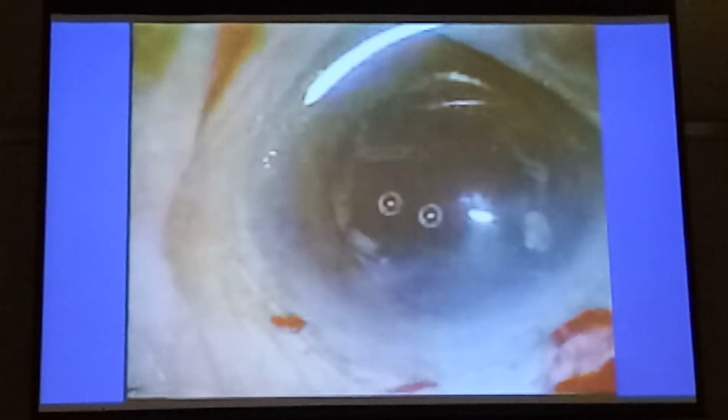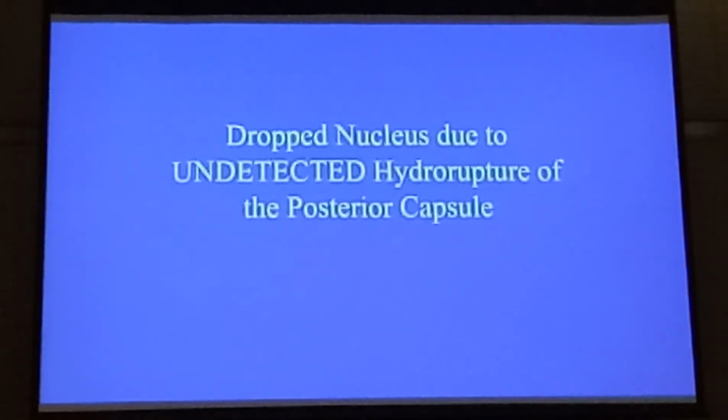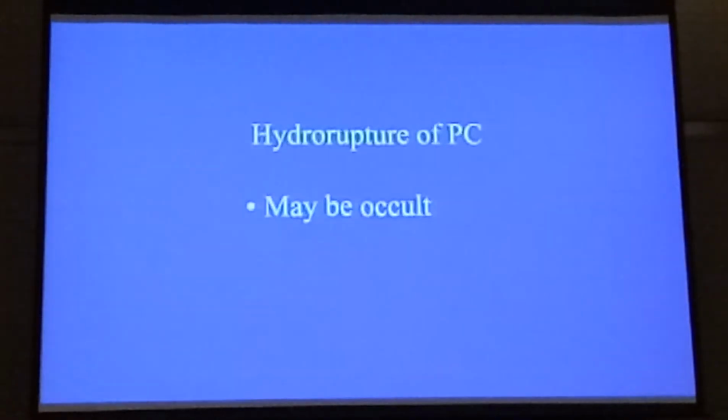Where's the nucleus? Where's the nucleus? It's on the macula. Right? It's on the macula. It hasn't gone up the Phacotip. This was a drop nucleus due to undetected hydrorupture of the posterior capsule.